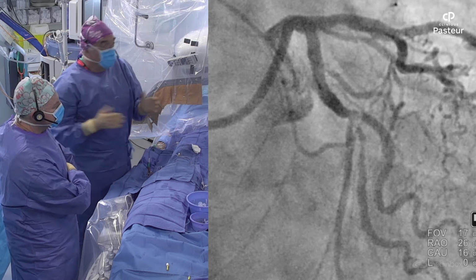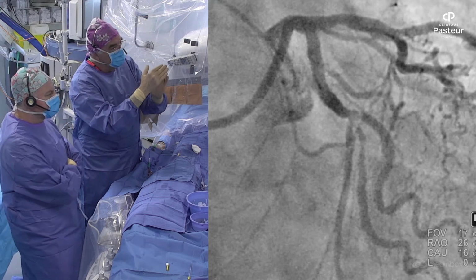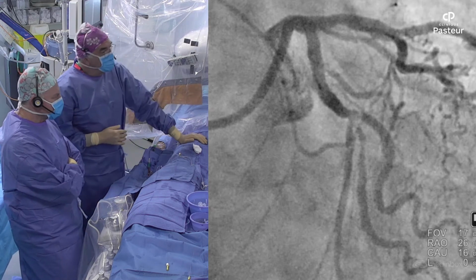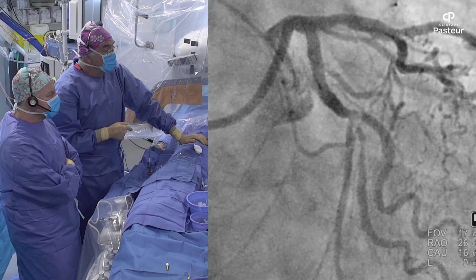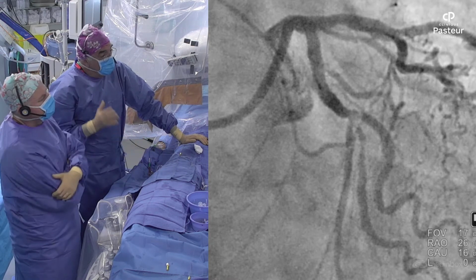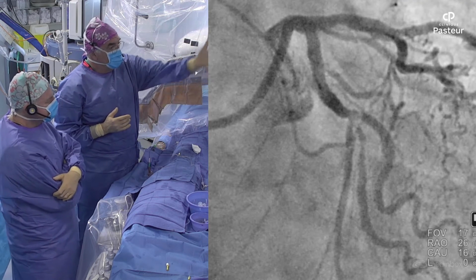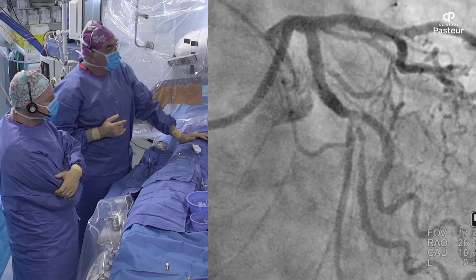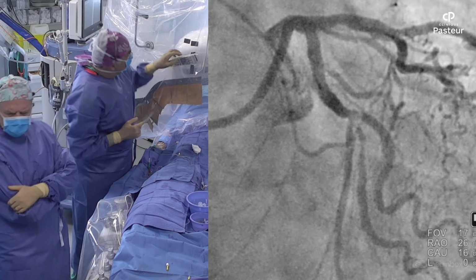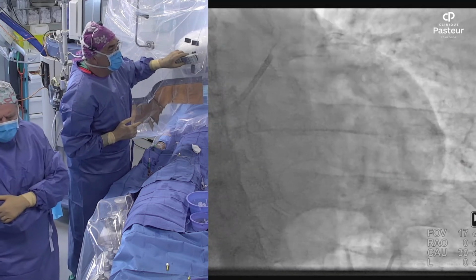That's the question. But anyway, when you consider the angle, it's around 60, 70 degrees between the two OM. So maybe we can consider, because it looks a little bit larger, the first OM as the main vessel, and the second, which is diseased, as the side branch. So what will be the plan? First, I can show you what we have seen in the LAO.